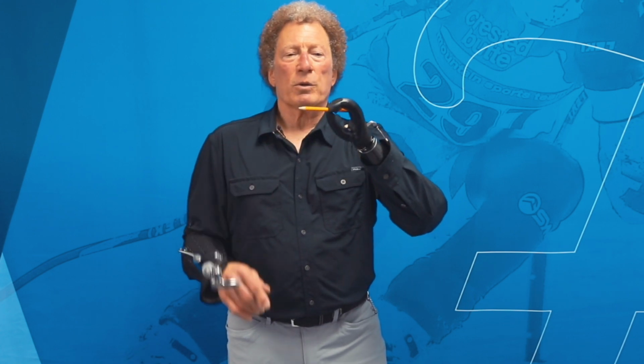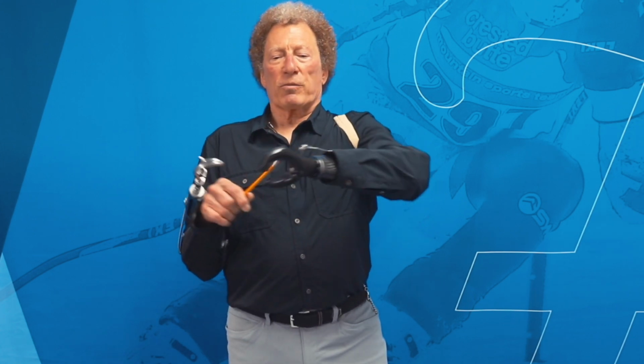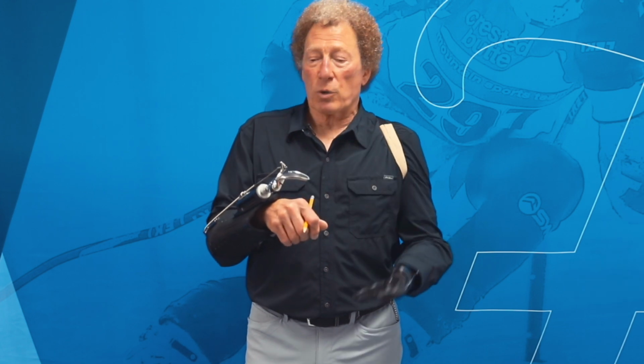I can get over 100 pounds of force on the inner areas of this device, easily generate 15, 20, 30 pounds on the tip, upwards of 50 or 60 pounds in the center. So it gives me a greater range and a progressive range of gripping force. The hook just can't give you that. If I was to try to get 100 pounds of hook force on this hook, I probably couldn't open it up.